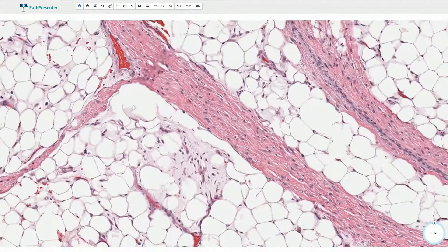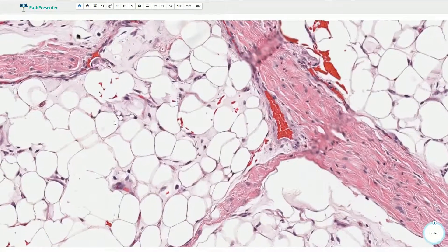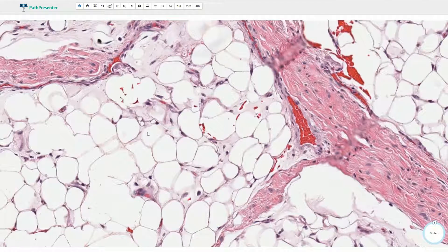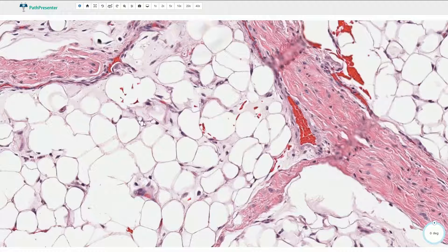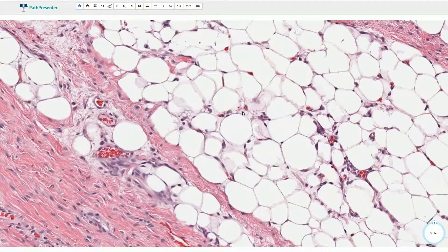We can also find immature adipocytes, also called lipoblasts. Lipoblasts are usually much smaller cells with multi-vacuolated cytoplasm and the nucleus which is pushed to one side. Here is another example: multiple vacuoles, relatively small cells, and the nucleus is pushed to the side of the cell.